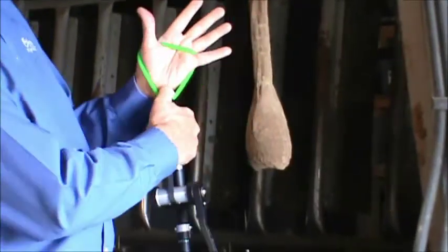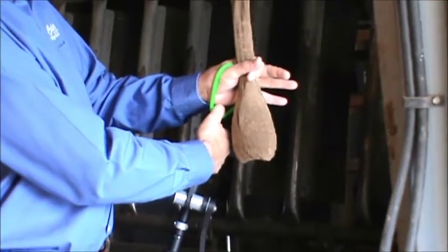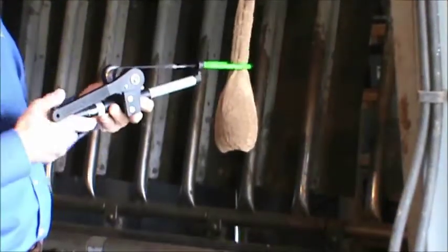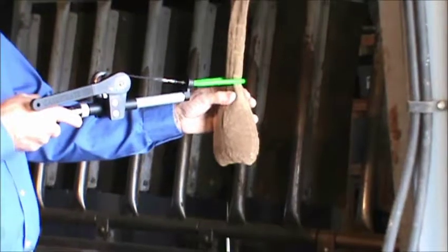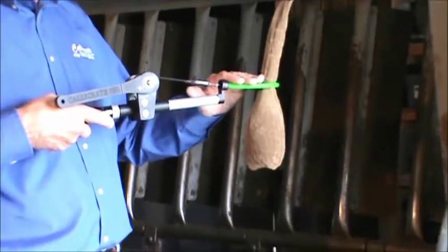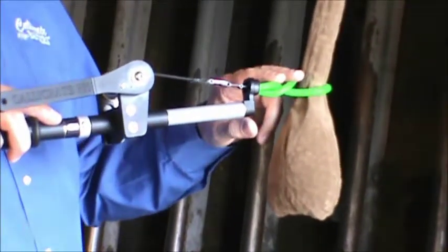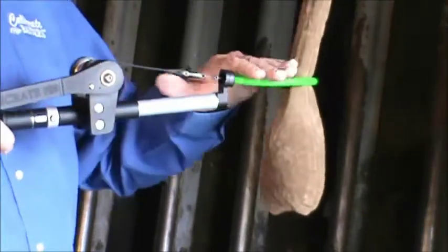Then I'm going to grasp the scrotum about one inch above the testicles and pull down on the loop over the testicles and above. Again, you want about one inch above the testicles. The next thing that's very, very important: make sure that all of this is in the same plane. What I mean by that is don't twist the rubber loop — there shouldn't be any twists in the strap. If you have twists in this rubber loop and you tension it, this self-locking clip is going to fail. Keep everything in the same plane.